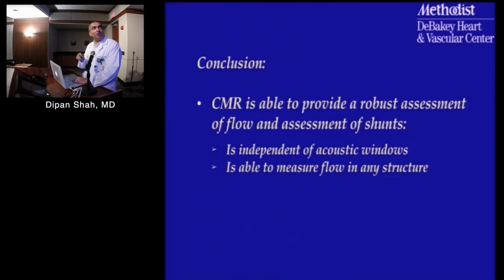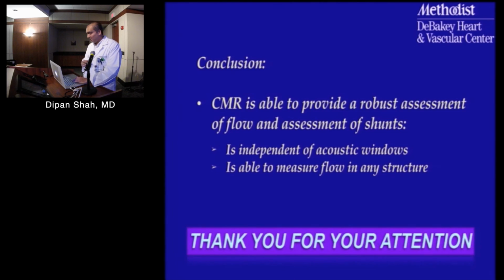To summarize, CMR is able to provide a robust assessment of flow as well as shunts, and is independent of acoustic windows. The advantage is that you can measure flow in any structure you want, whether it's ASDs, SVC, IVC flow, or any part of the aorta that you're interested in. So I think CMR definitely has a role for assessment of hemodynamics in certain patients. So let me pause there. Thank you for your attention.